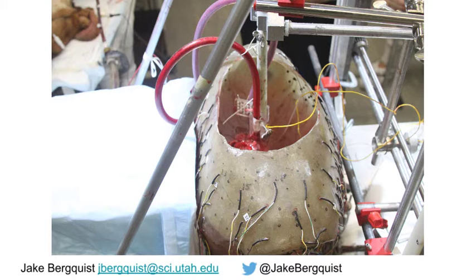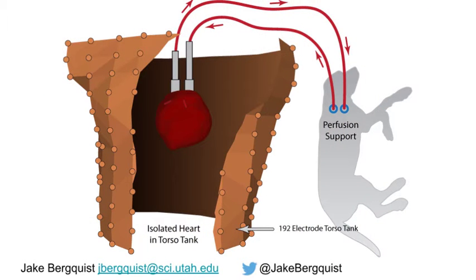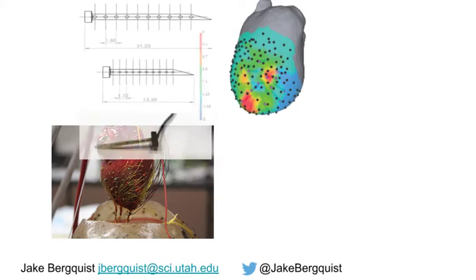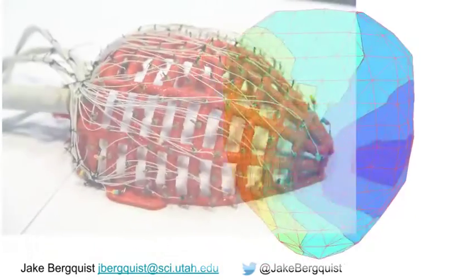To control for cardiac sampling, we've developed several novel recording arrays. This includes the 192 electrode torso tank, which records from silver-silver chloride electrodes embedded in the tank itself. Additionally, we utilize a range of recording arrays to record from the cardiac source itself, including an epicardial sock, intramural plunge needles, and, most recently, a novel pericardiac cage.